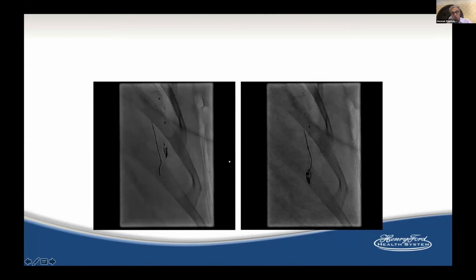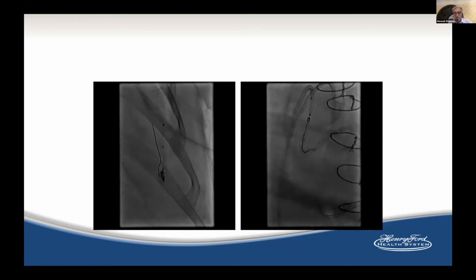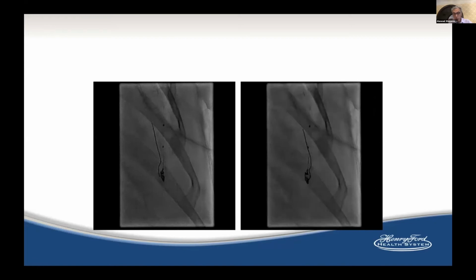When you pull something like trash from the coronary artery, you need to watch it coming all the way out, away from the great arch vessels, because you don't want it to go to the brain. Here we're trying to capture it, we couldn't. And so we finally captured it here, and we pulled it all the way out, and we watched it. You need to watch it really well. And I like the big guides also for this reason, because if you end up having trash down the coronary artery, you can actually pull it back through these guides.